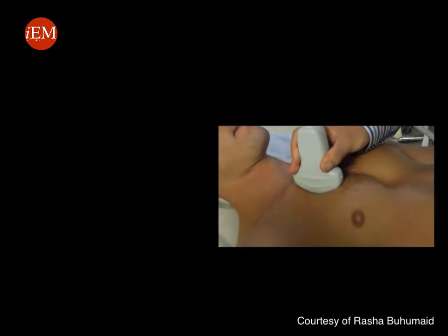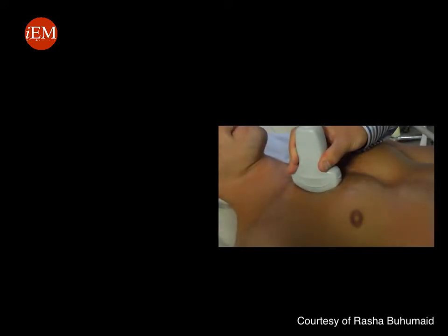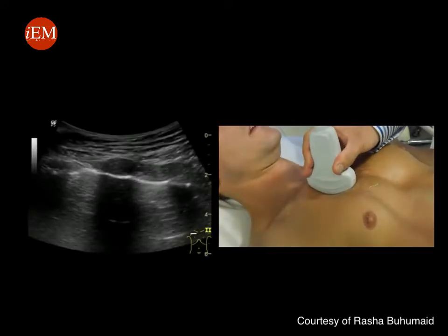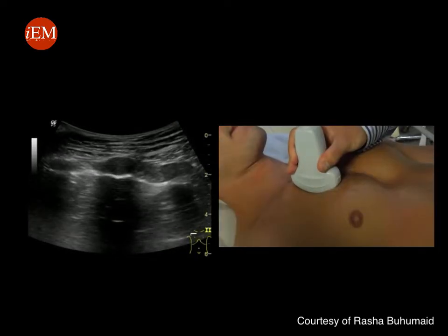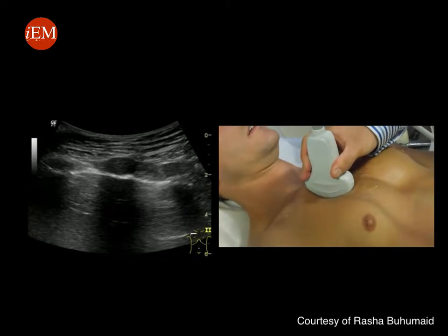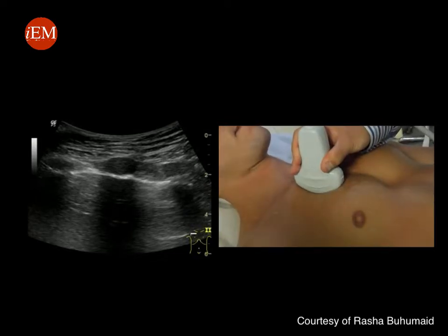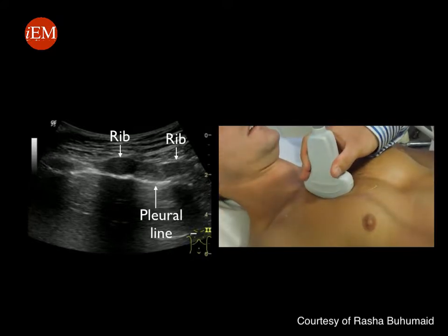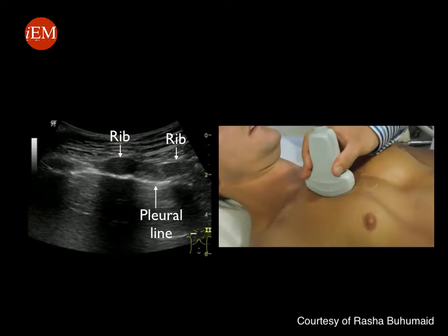Place the probe perpendicular to the anterior chest wall, probe marker towards the patient's head. This is the corresponding ultrasound image that you will try to obtain. Notice that the depth is decreased here, and the anatomical landmark you are trying to identify is two ribs and the pleural line in between the two rib spaces.